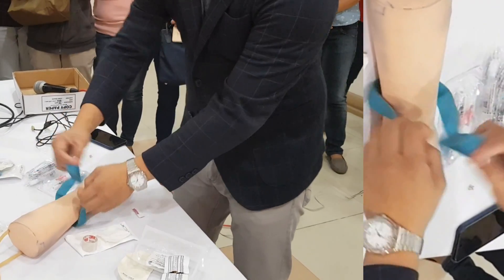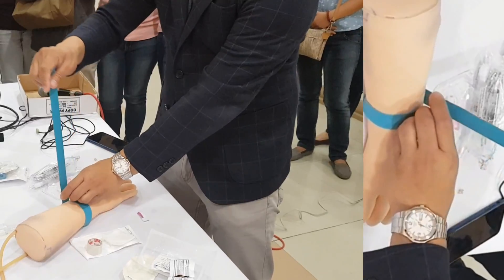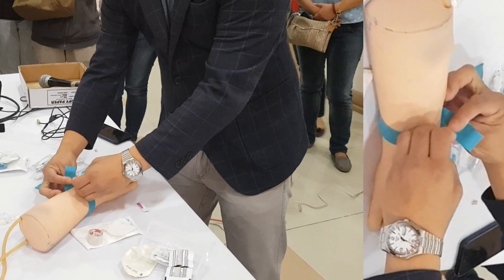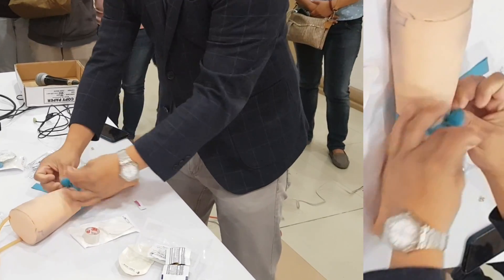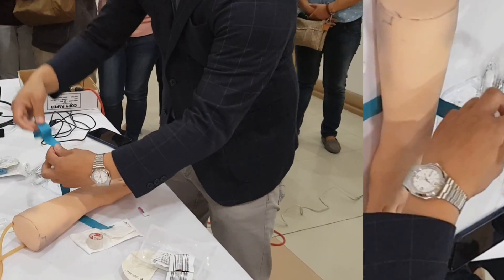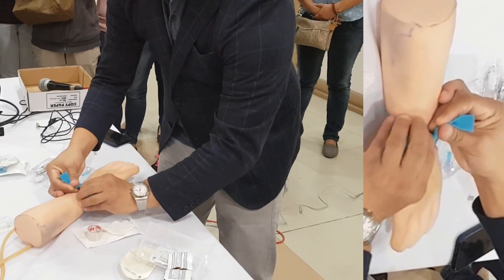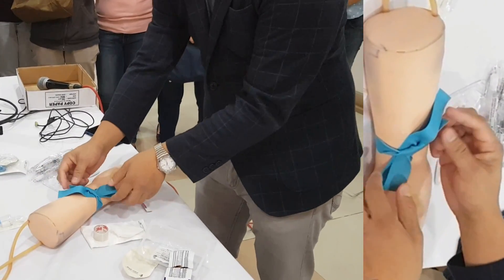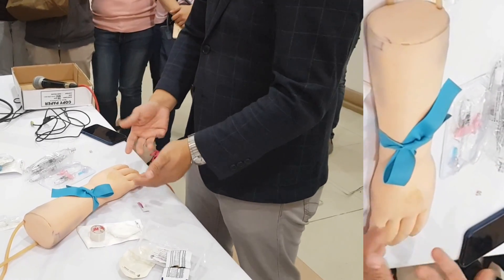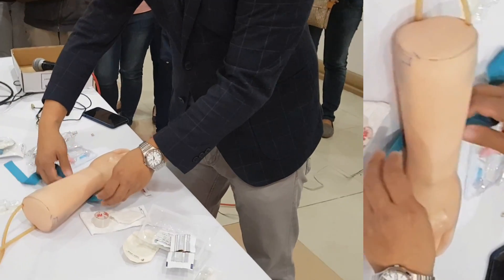Unlike what we normally do — when we're just shown how to apply the tourniquet — you end up hurting your patients. So let me do that again: create a low loop, then right over left. If you apply the loop somewhere too high up, most of the time you can't tell where your shorter or longer side is, and it doesn't look tidy at all.